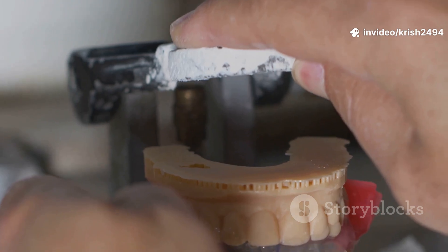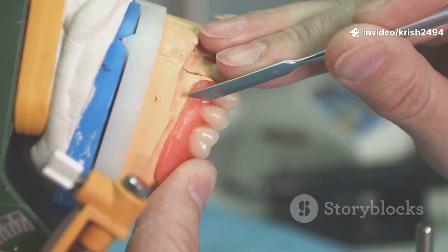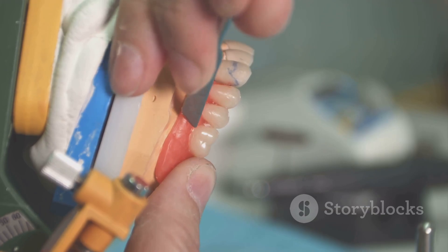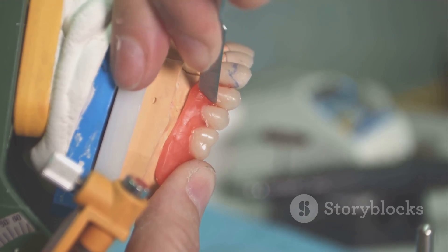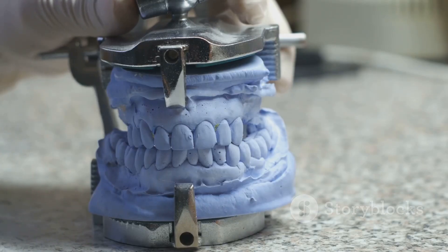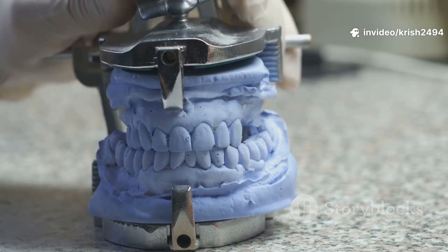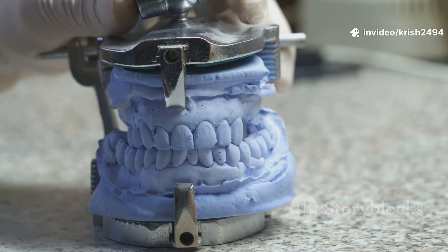Now, final impressions. With your custom tray, the dentist does border molding — think of it as sculpting the edges to make sure the tray fits every nook and cranny. Then a more precise impression material, like zinc oxide eugenol or PVS, is used. This gives the lab a super accurate mold called the master cast.